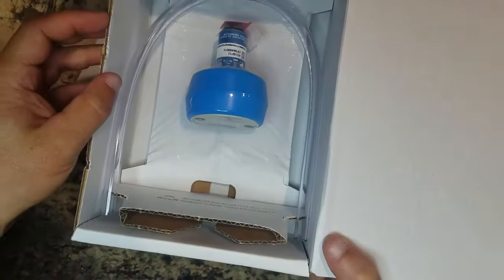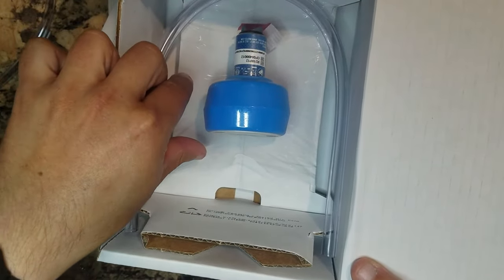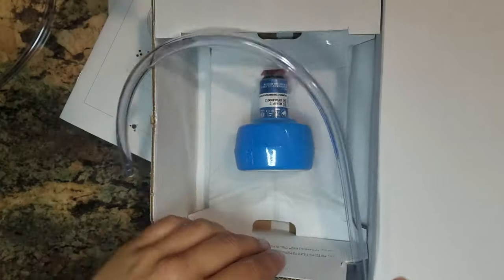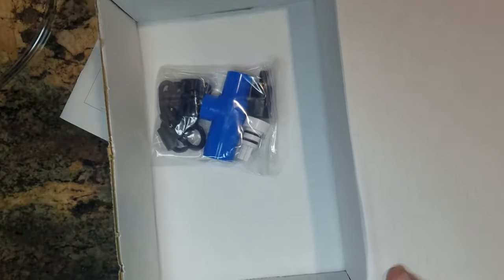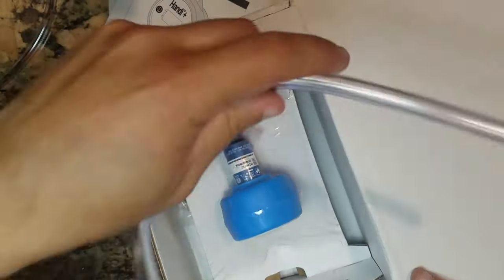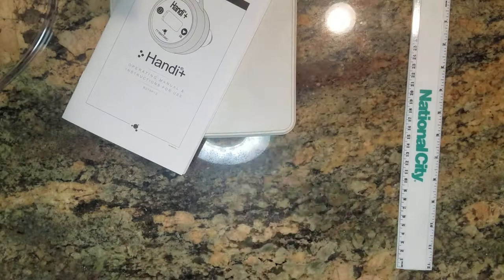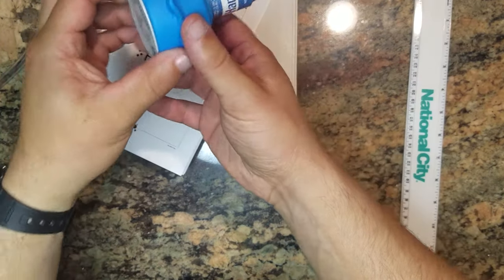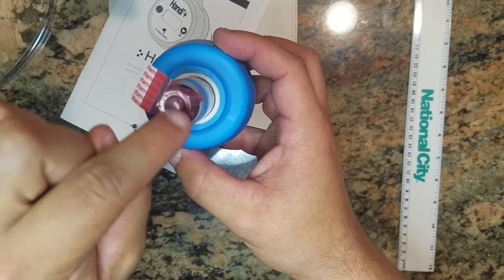There's your instrument, which comes wrapped in plastic wrap. You also get a hose, and underneath is a bag of accessories. I have one open and I'll show you how that stuff works.